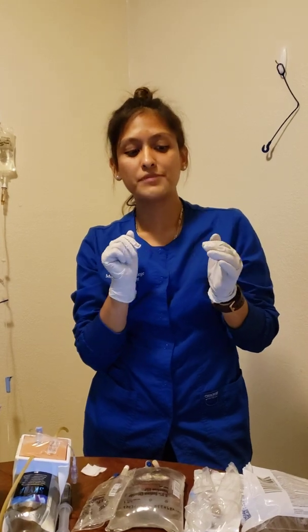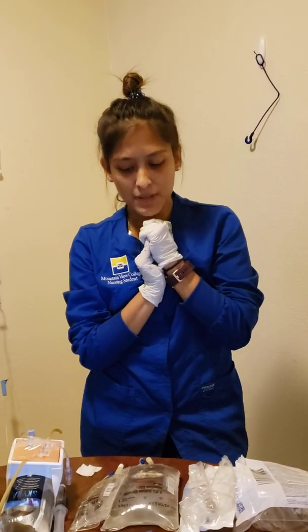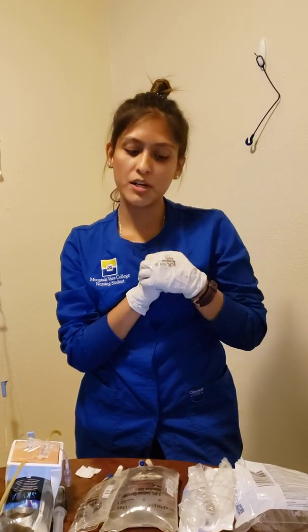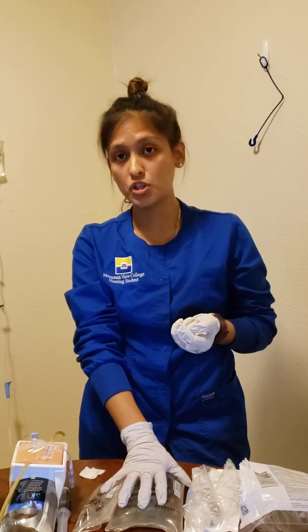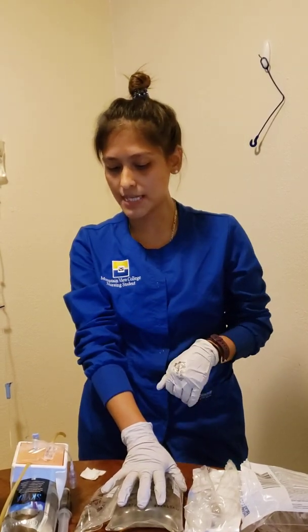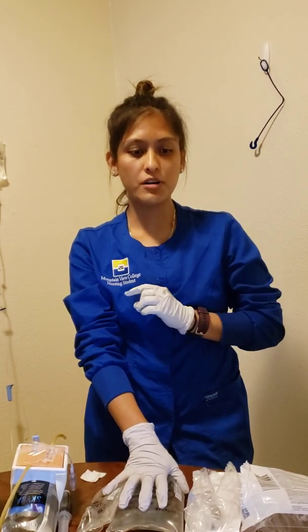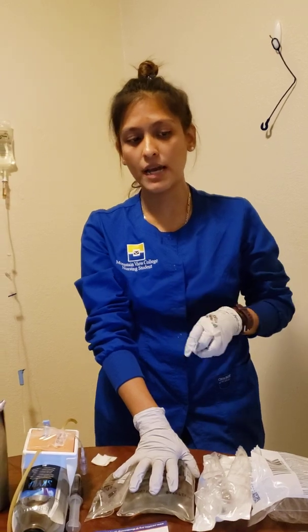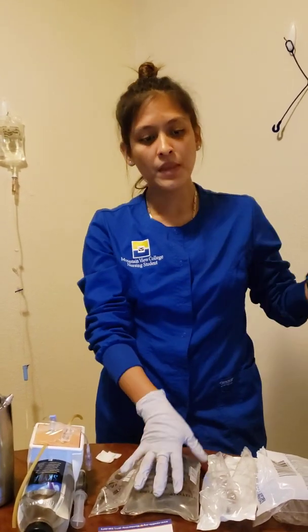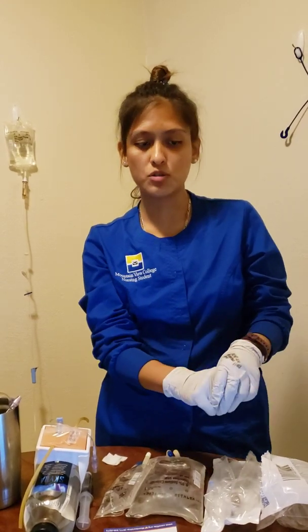So knock knock, I'm coming in, I'm performing hand hygiene. Hi Miss Chi, my name is Kelly, I'm going to be your nurse today. The doctor has ordered some fluids and a med to give to you today. Is that okay? She says yes. Thank you very much, Miss Chi. Could you just verify your name and your date of birth for me? Wanda Chi, 9/20/19XX. And do you have any allergies? She says no. I've pulled up my chart here just to make sure that this is for Miss Wanda Chi.